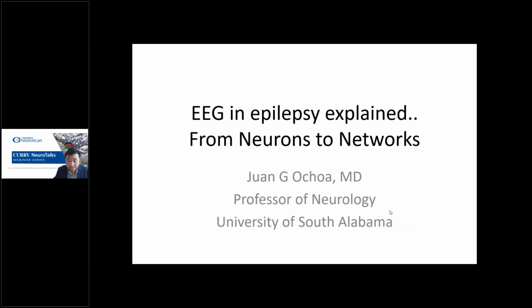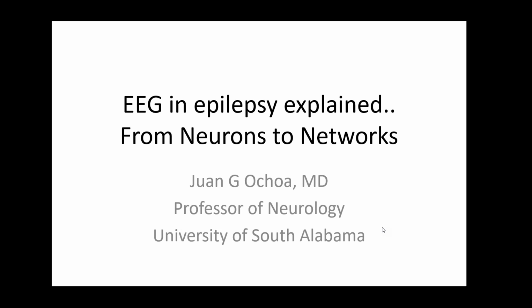Thank you, Wade. It's my pleasure to present today here at NeuroTalks. What we're going to talk about today is a little bit of the basics of what the EEG is. I'm going to start from the neuron networks to explain how the EEG looks and how epilepsy happens.